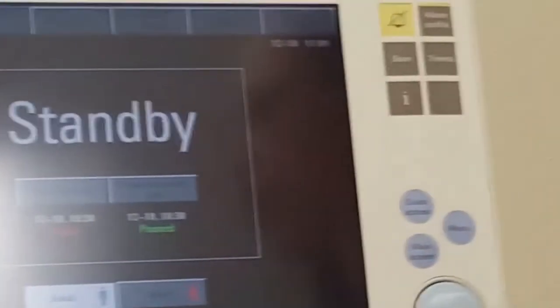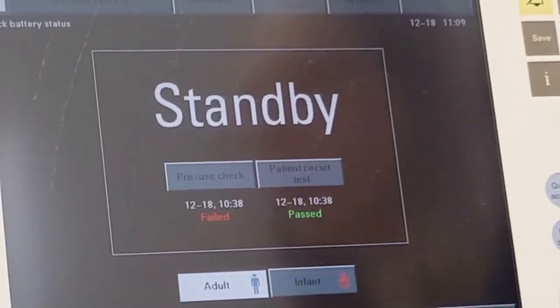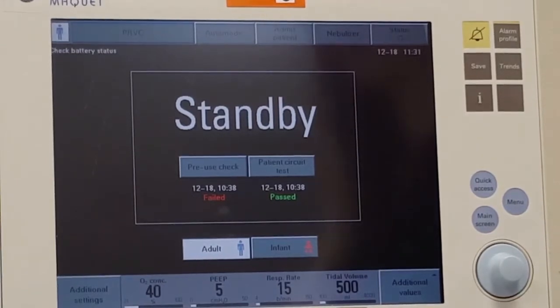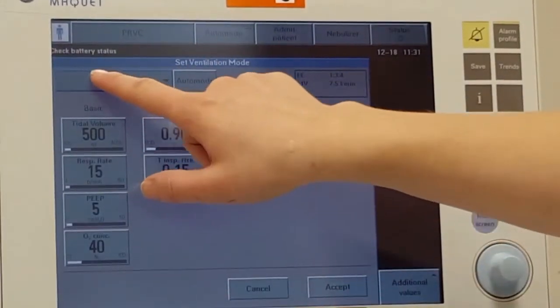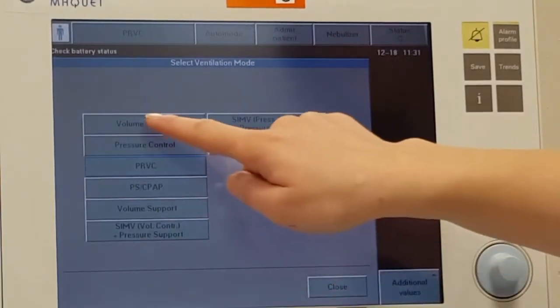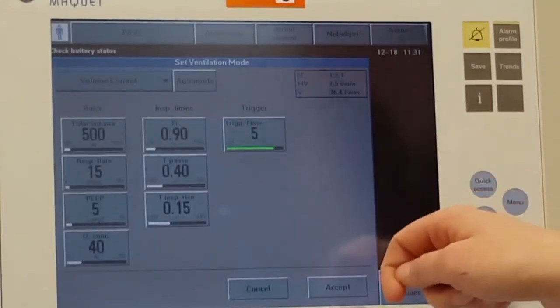And then we're going to go ahead and check our orders or look at our care plan to see what we need to have set for ventilator changes for this patient. So our order for this patient is first to place them in volume control ventilation. In order to change your mode on the Servo-I, if you click the top left, it'll bring open your settings screen. And then again, the top left of that screen, it's going to bring all the possible modes. So our order is volume control. It will automatically bring up the default for volume control.